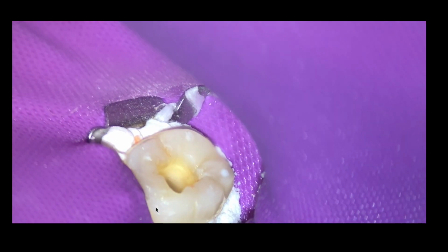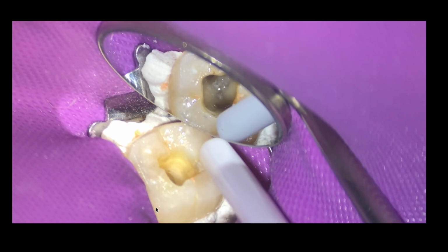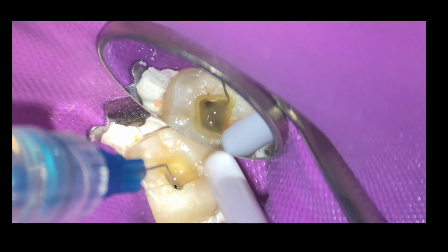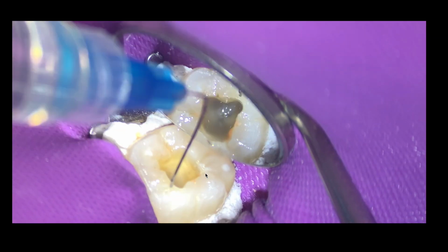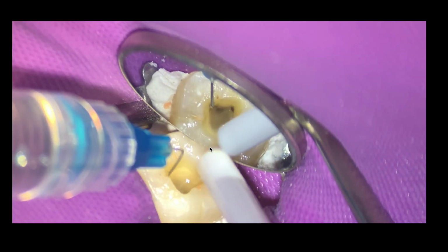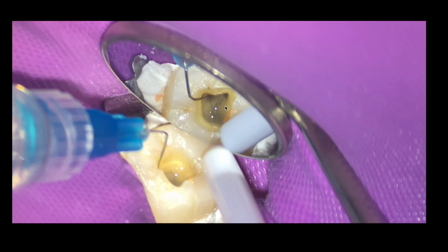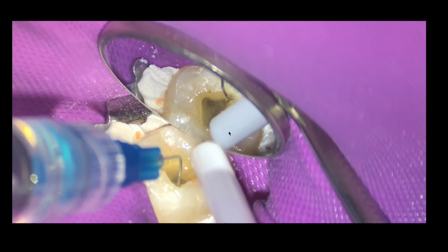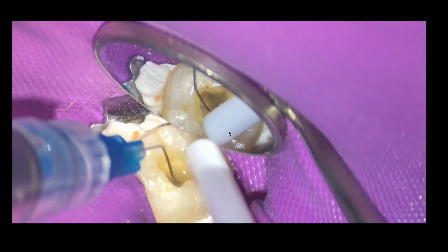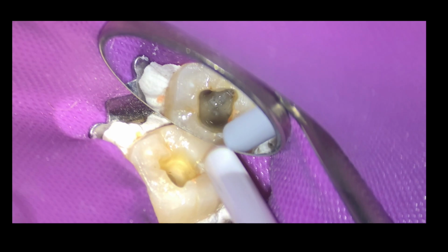All right, so let's keep going here because this is a little bit boring. So just activating. One of the things that I find interesting is, see if I can get it, it's translucent. See how the irrigant is translucent? Once I start irrigating, it just clears out all that material. So I'm hoping, and that's really what it is, I'm trying to get all of that junk out of the canals to make sure we get a great outcome, because that's what we're looking for.